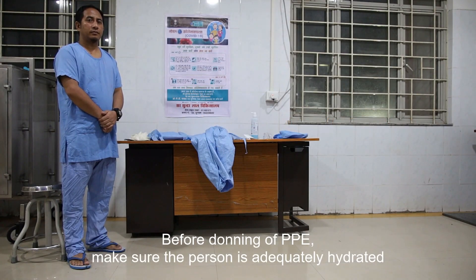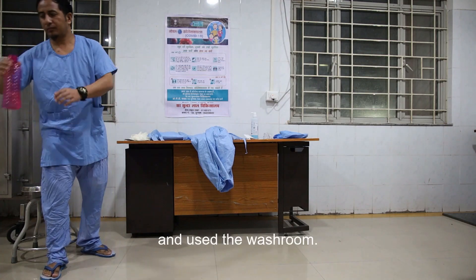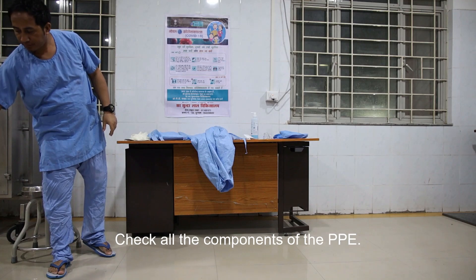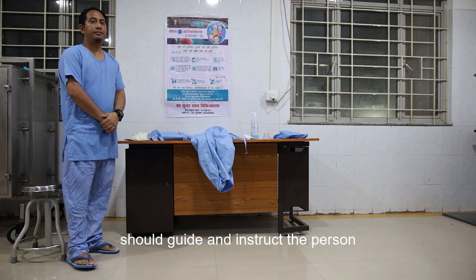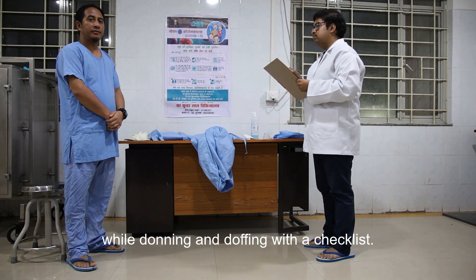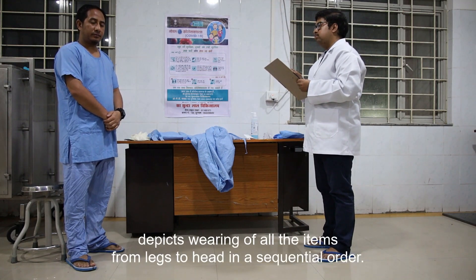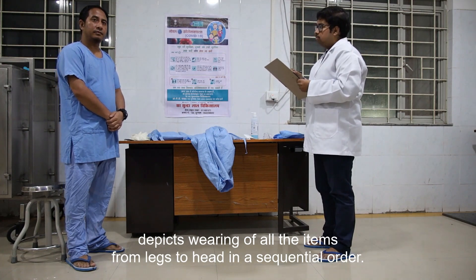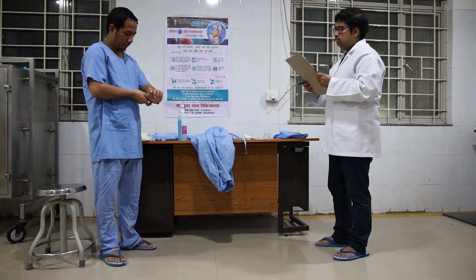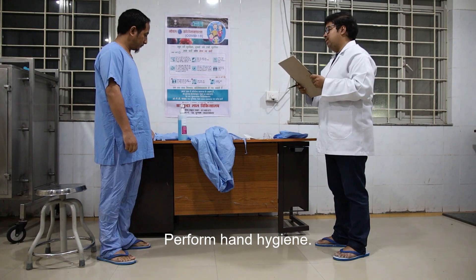Before donning PPE, make sure the person is adequately hydrated and has used the washroom. Check all the components of PPE. A second person should guide and instruct the person while donning and doffing with a checklist. The present protocol demonstrated here depicts wearing all items from legs to head in a sequential order. Remove all personal items, secure a hair tie if required, and perform hand hygiene.